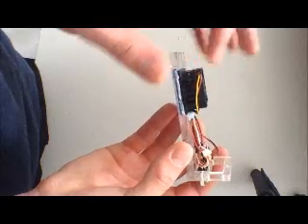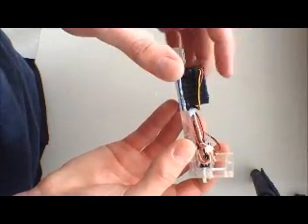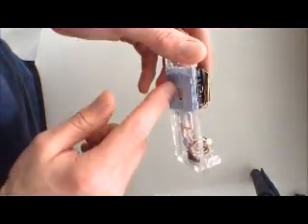Okay, this is the device itself. As you can see, there is a fan and heatsink combination, so the fan spins to hopefully remove heat from the base of the heatsink, which is connected to a Peltier device.